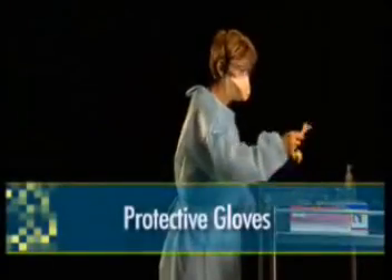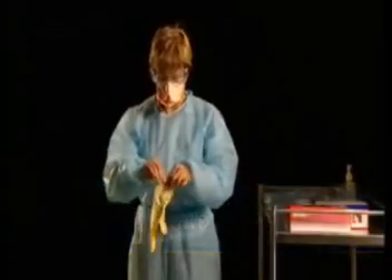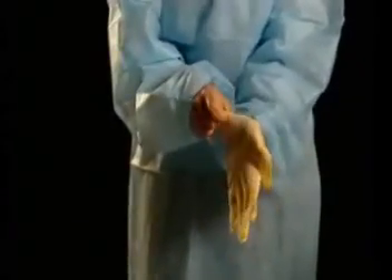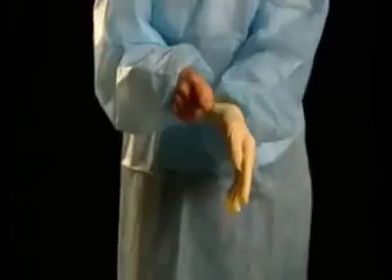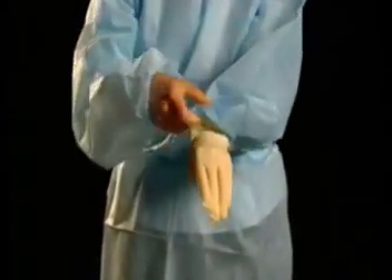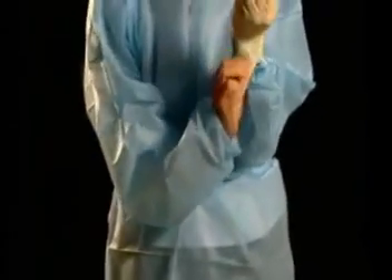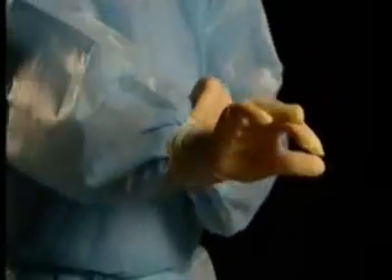Wearing disposable protective gloves reduces the potential for skin contamination. Fit the first glove on your hand, then pull the end of the glove over the cuff of your gown. This will make a tight seal, reducing the potential for contamination of the wrists and forearms. Repeat this for the second glove. You may initially experience difficulty doing this, but with practice it will become easier.